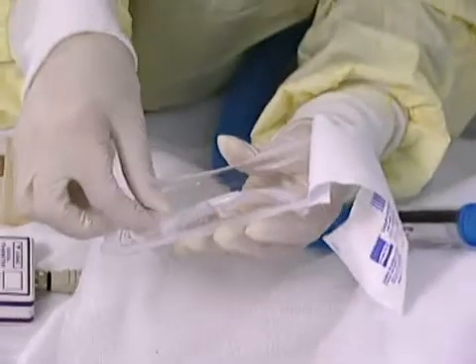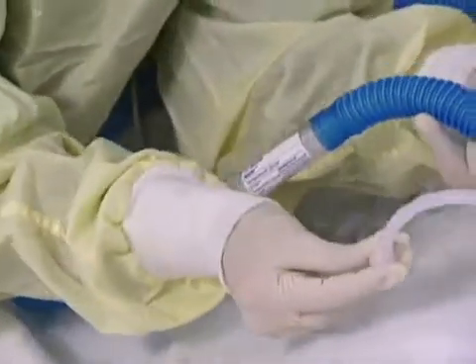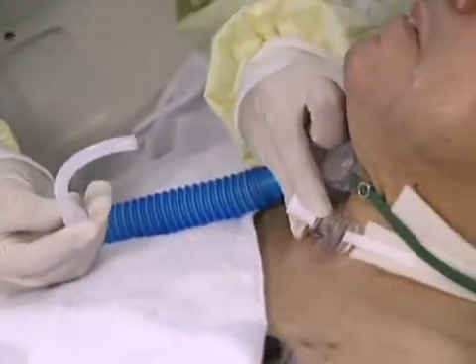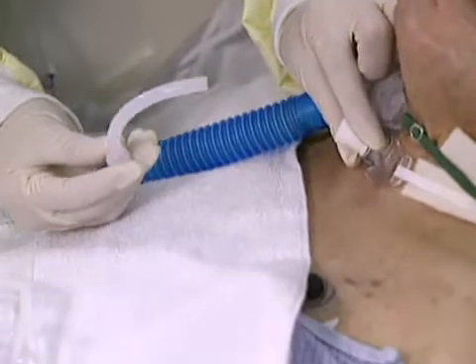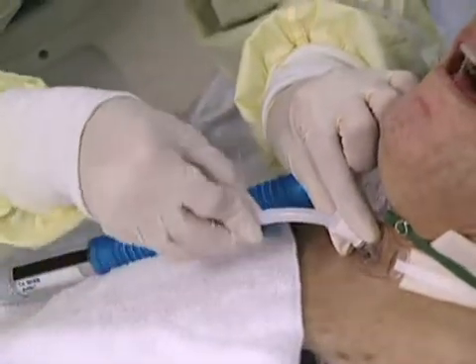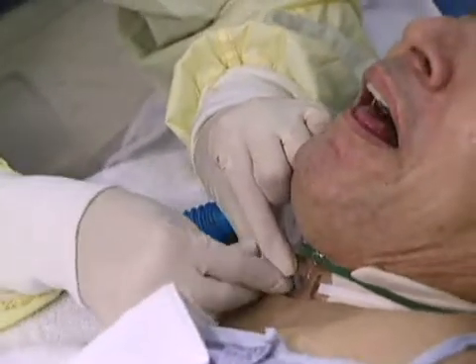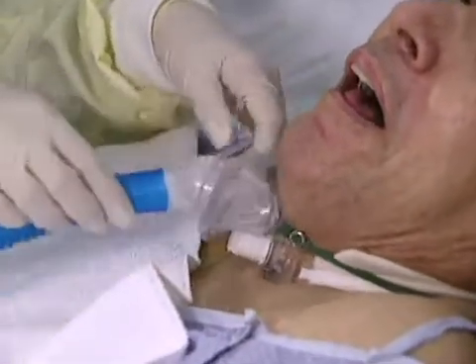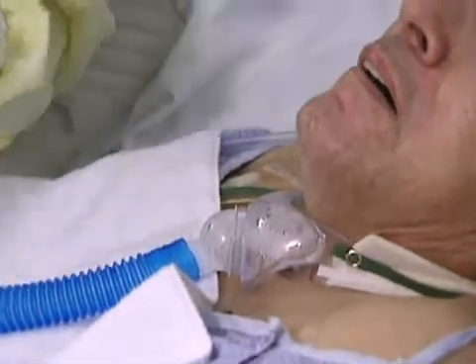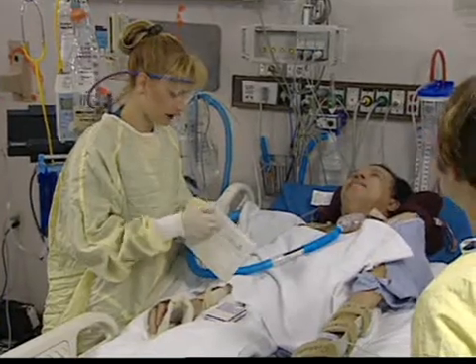So I'm going to pick this up, and then I'm going to insert it. And what I'm going to do is I'm going to stabilize his trach by holding on to the exterior flange and insert this here. And sometimes you have to manipulate it just a little bit and slide it in, and then it clicks into place. And we're done. The next thing I'm going to do is put the new drain sponge up underneath of there.